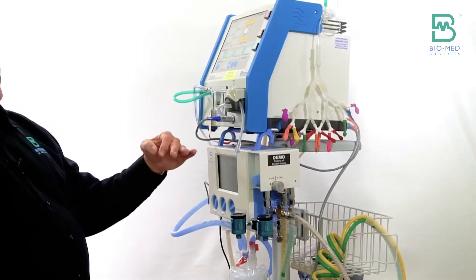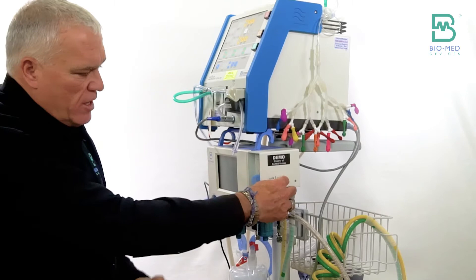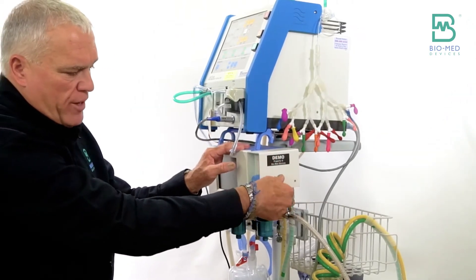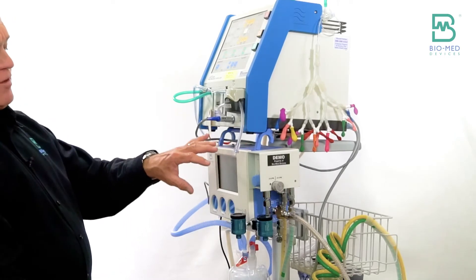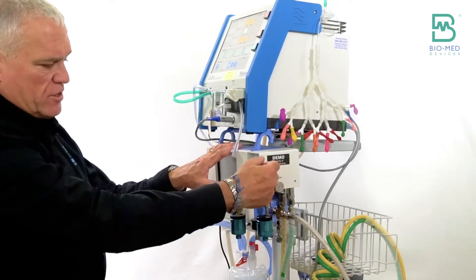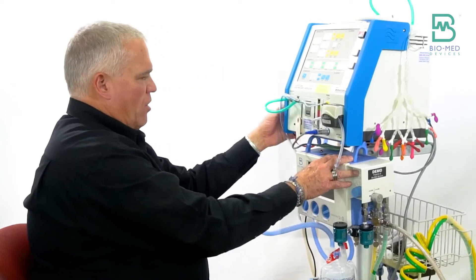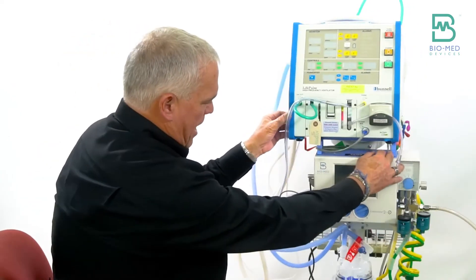If you need to use flows less than three liters, in order to be accurate, you turn that to less than three. Since you're going to use the Crossvent at greater than three liters, you can just leave this to the greater than three position so that it'll always be accurate.